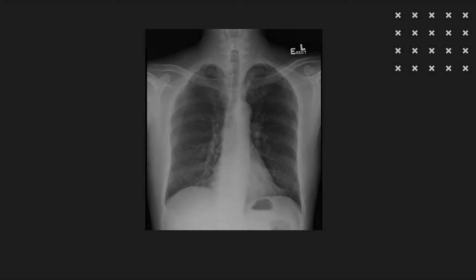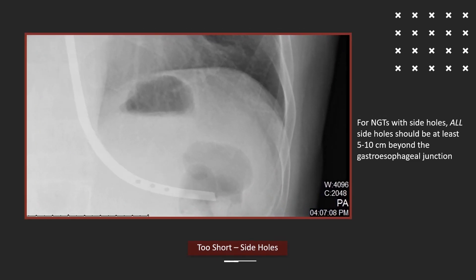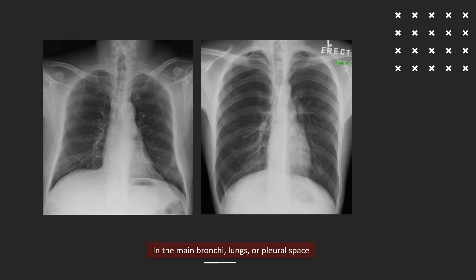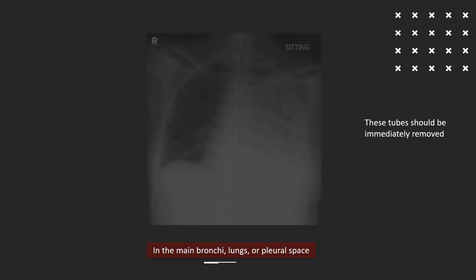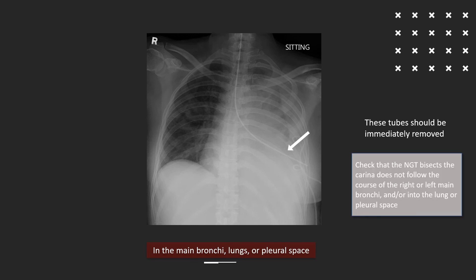Note that if the tube contains side holes, all of the side holes — and not just the tip — must be distal to the gastroesophageal junction to decrease aspiration risk. The tube should not enter the main bronchi or the lungs, to avoid airway or pulmonary injury. Inadvertent placement and advancement of the tube even more distally can extend the tube into the pleural space.